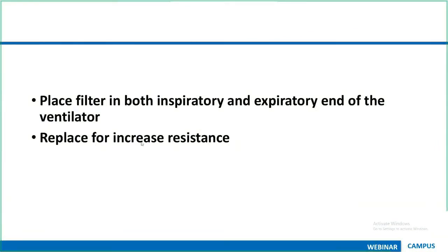Replace the filters if the resistance is increasing. This is a very, very common mistake we are observing in the ICUs nowadays. You will be putting the patient on a viral filter, and somebody will be giving nebulization. Obviously, when you nebulize using the filters, these filters will get more clogged and the resistance will increase. Obviously, the ventilator won't be able to push the air through that filter. Your airway pressures will go high.